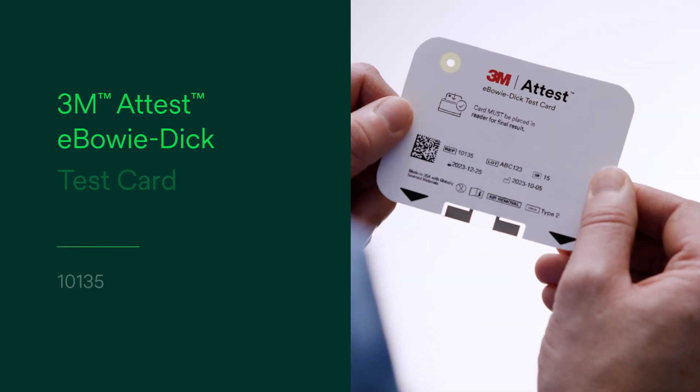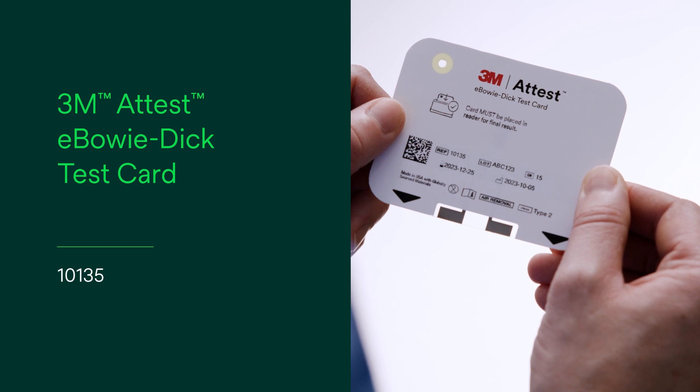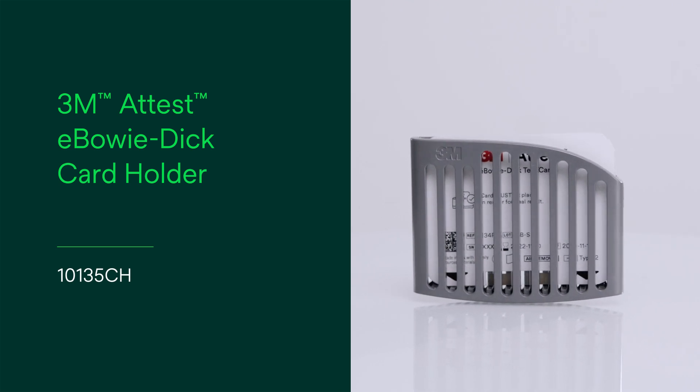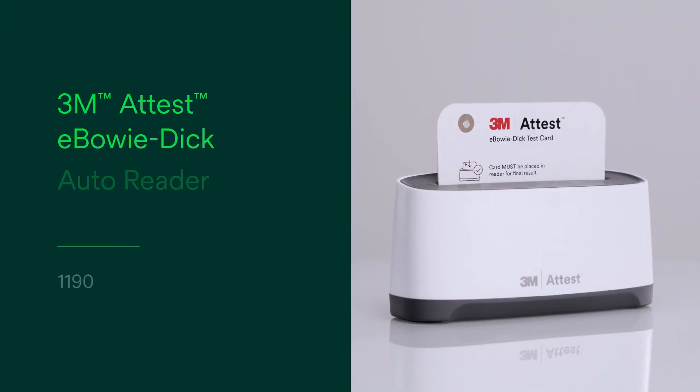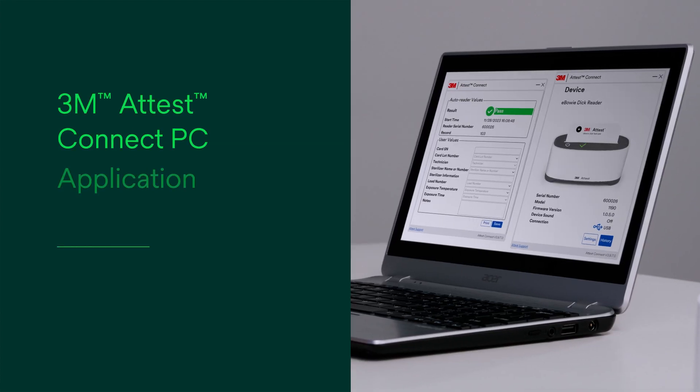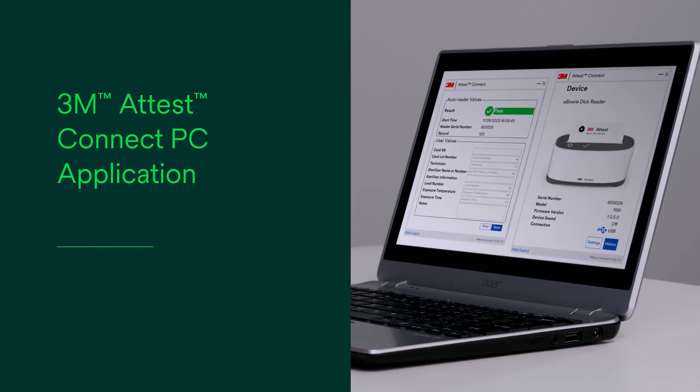The test system includes the 3M ATest eBowieDIC test card 10135, the 3M ATest eBowieDIC cardholder 10135CH, the 3M ATest eBowieDIC autoreader 1190, and the 3M ATest Connect PC application.